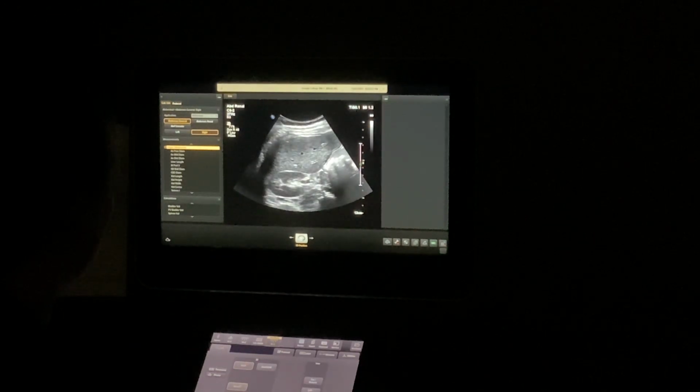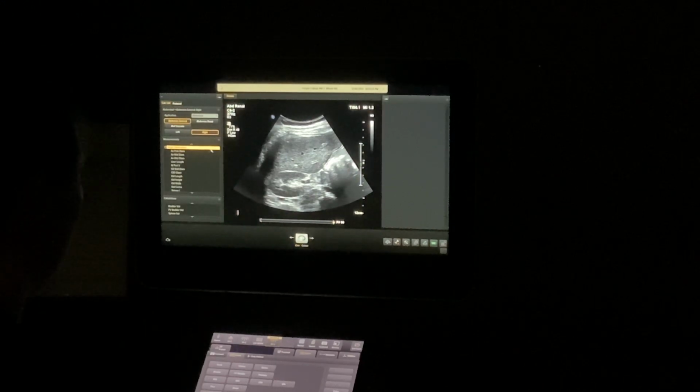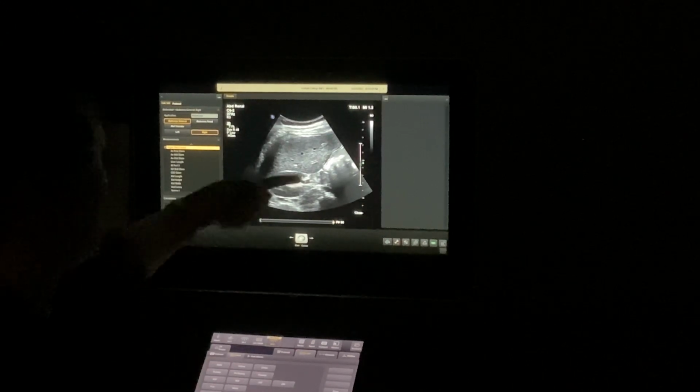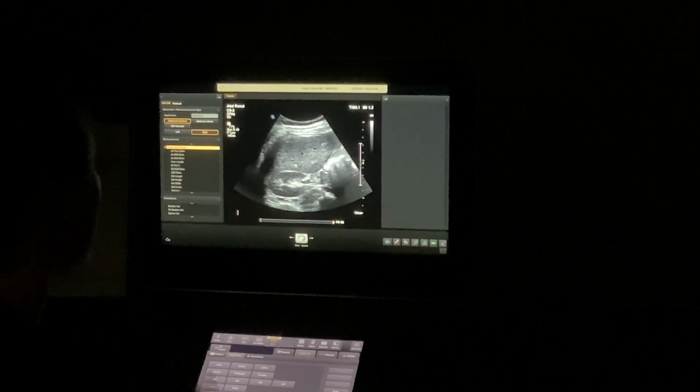And breathe. This is transverse mid kidney, okay? It's going to look like a horseshoe or a C shape, and that is the goal, nice and even. Again, if I am cutting this in half and folding it, both of those sides need to match each other as best that you can prove. So this C shape here is going to be the mid portion.